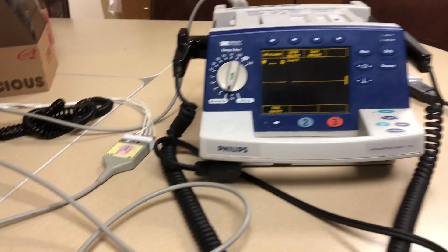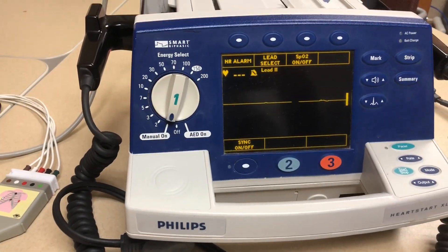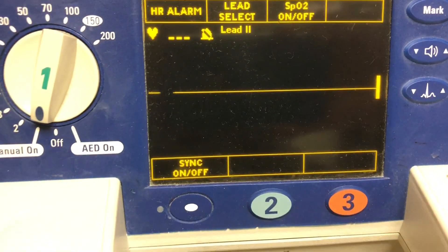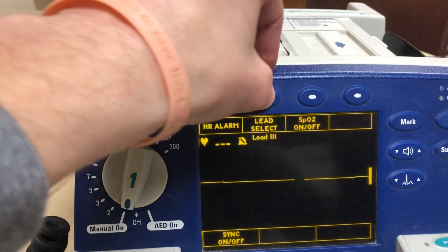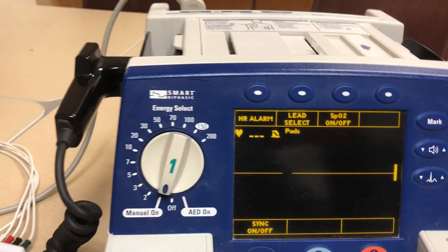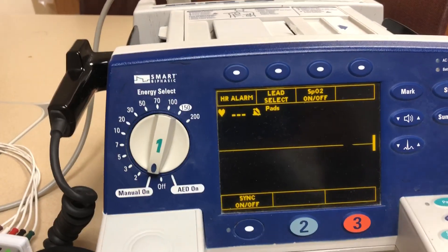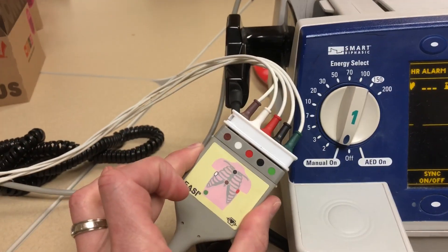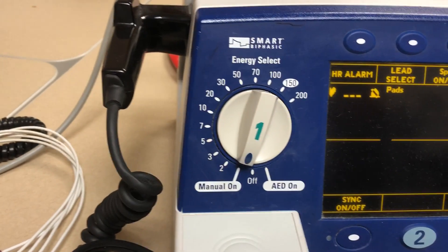Big thing is you're going to hook up your patient, you throw those R2 pads — the defibrillation pads, that's what they're called — on the patient and you're like, I ain't got no rhythm. Remember you've got to hit your lead select up here and cycle through to pads. Then you should have a rhythm, because the pads will actually identify the rhythm. So you'll be able to get the rhythm from the pads — you don't actually have to have the leads on the patient.